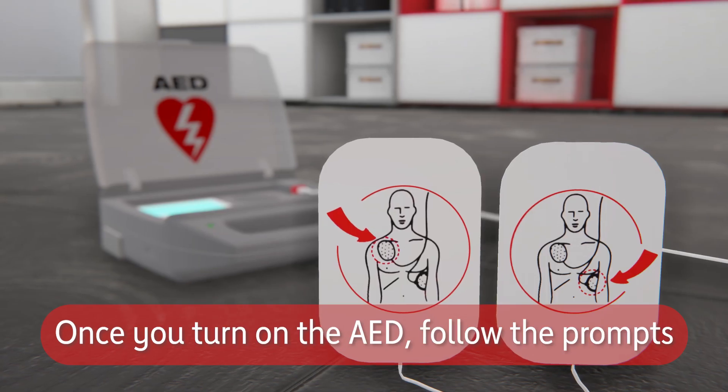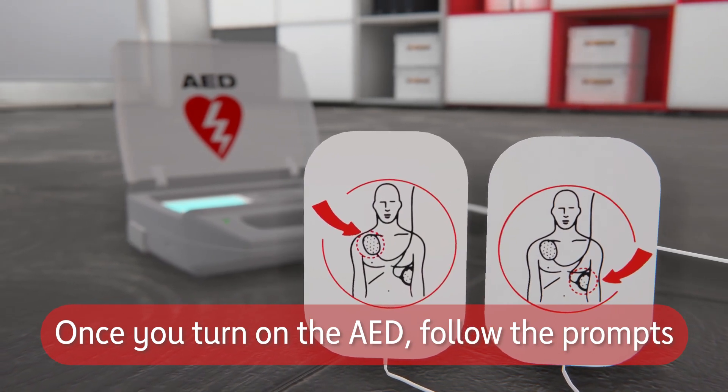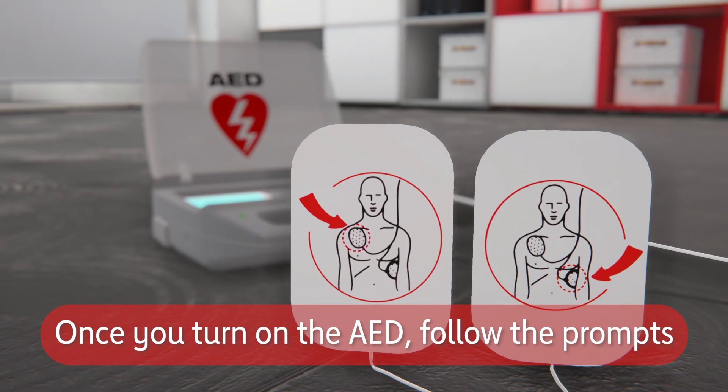Once you turn on the AED, follow the prompts. The AED will check to see if the person needs a shock and will prompt you to deliver a shock if needed, or resume CPR.